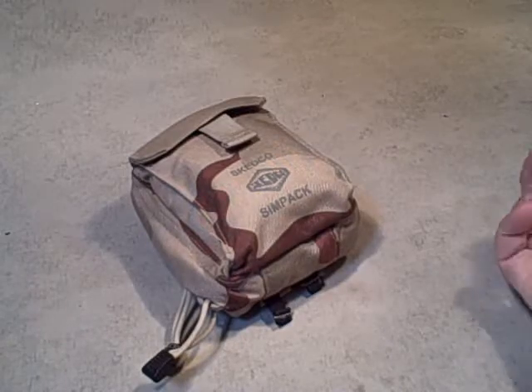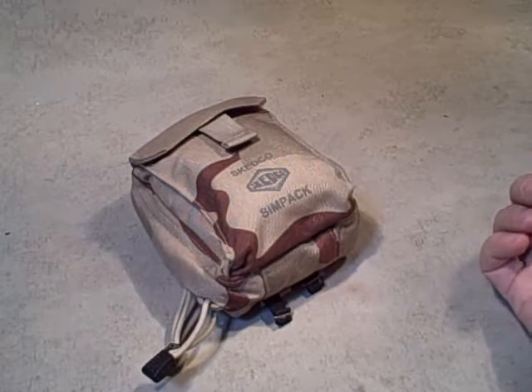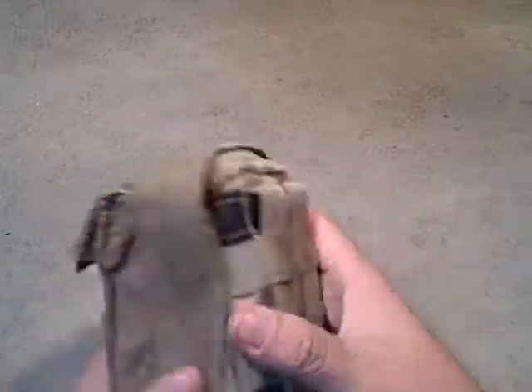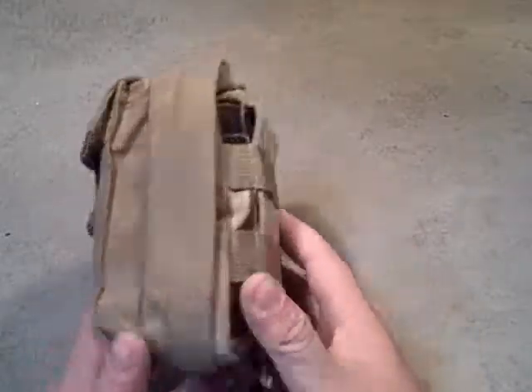I'm taking a look at a first aid kit — actually a trauma kit — made by Skedco. It's a sim pack, and this is issue as far as I know. I bought it from a surplus place at a gun show one time.